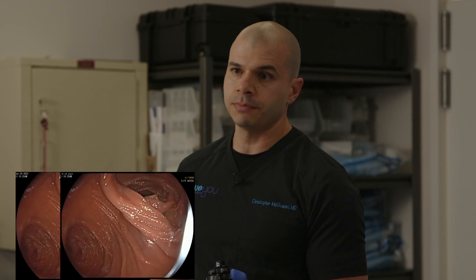Okay, so what I'd like to do first is just examine the pouch, make sure it's healthy, and hers is quite healthy. Pretty normal size pouch. Outlet is, if I were to estimate, about 25 to 30 millimeters in diameter. When this was originally made years ago, her initial size was probably around 15 millimeters. The bypass down here, small intestine, has two components. There's a blind limb, this does not go anywhere, and then this is where food would traverse, which is the roux limb. And I noticed that she has a couple of staples here from her surgery.